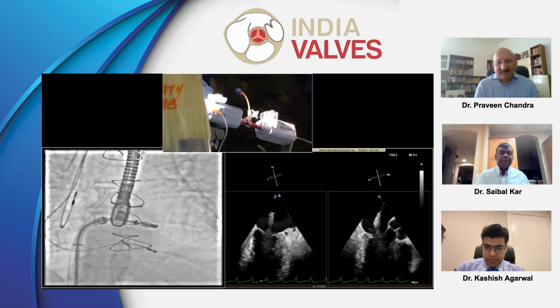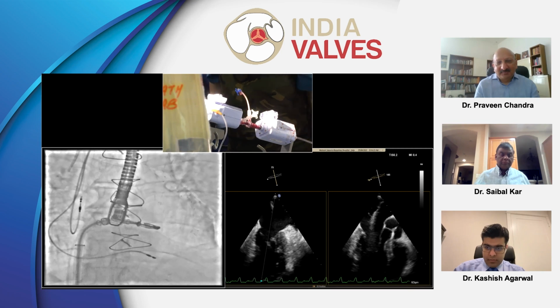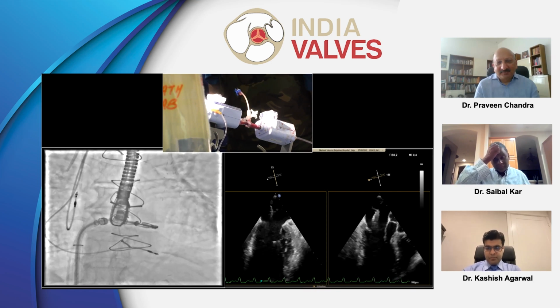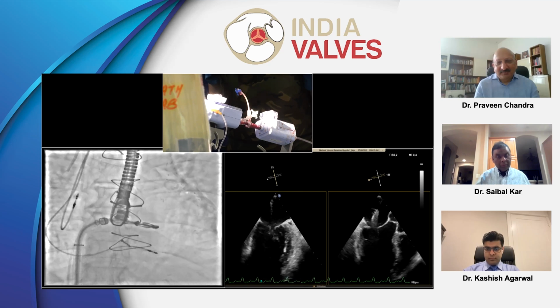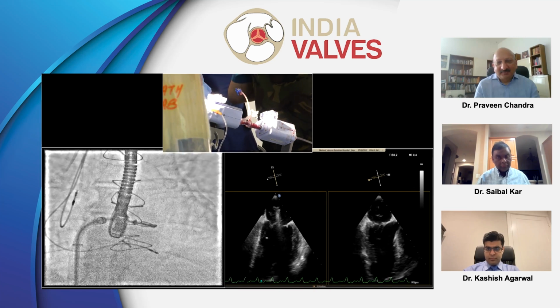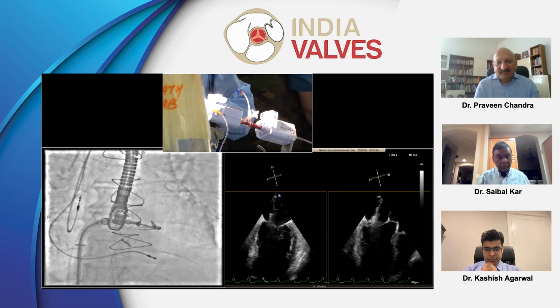Okay, so we're going to unlock the clip. Do you think we should assess which is anterior, which is posterior after opening? Yes, of course. Okay, so we raise the grippers, we unlock the clip. We're going to open the clip. Okay, Prashant, just focus on the clip arms.